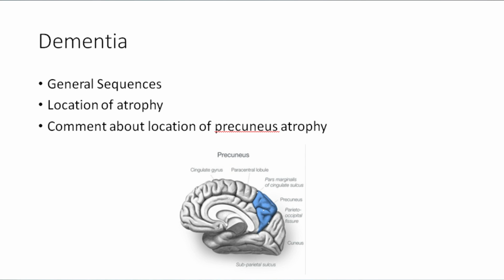And then, how many of you knew about the precuneus area? Did somebody ever look at the precuneus area? This is a key sign or key component we check for Alzheimer's dementia, the most common dementia. We need to look for the precuneus atrophy. We are not looking at that. How can we comment? Alzheimer's dementia is the most common one. We can do the screening, we can do the clinical assessment, but we need to confirm. And sometimes even imaging doesn't confirm. But we need to look more.